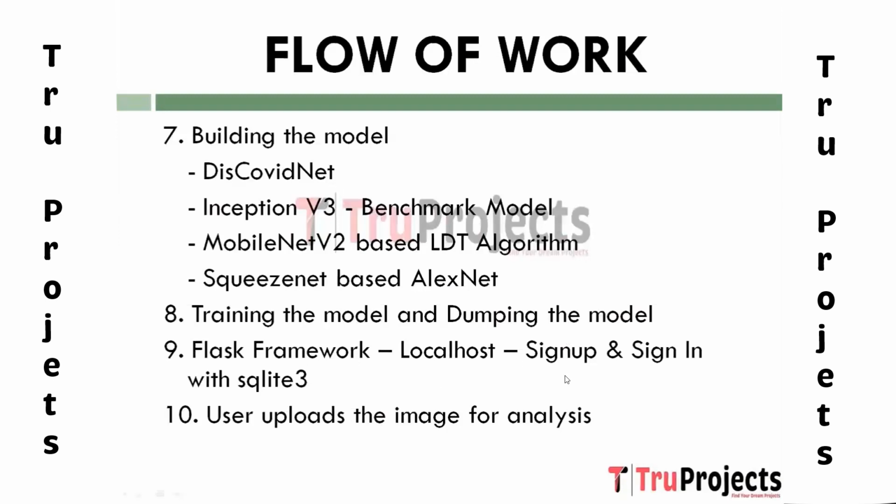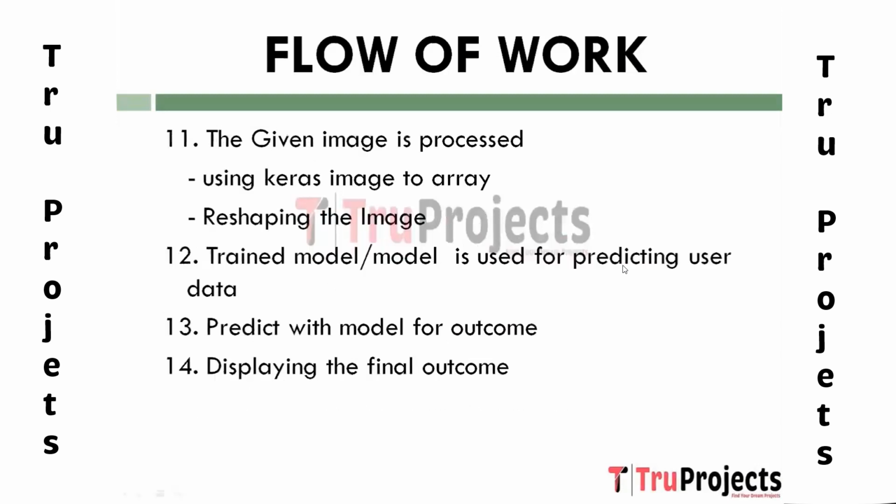Ninth, we have the Flask framework, localhost sign up and sign in with SQLite 3. Here we implement a web application using the Flask framework to provide user functionalities for sign up and sign in with SQLite. Then we have the user uploading the image for analysis, allowing users to upload images to the web application for COVID-19 analysis using the trained models.